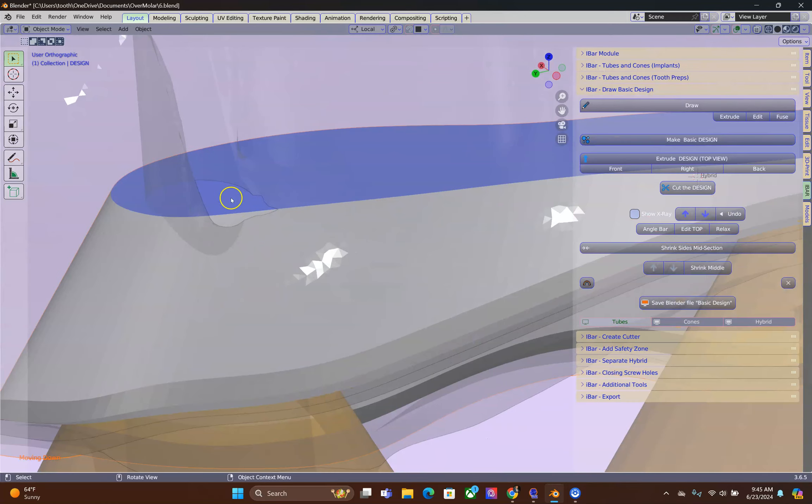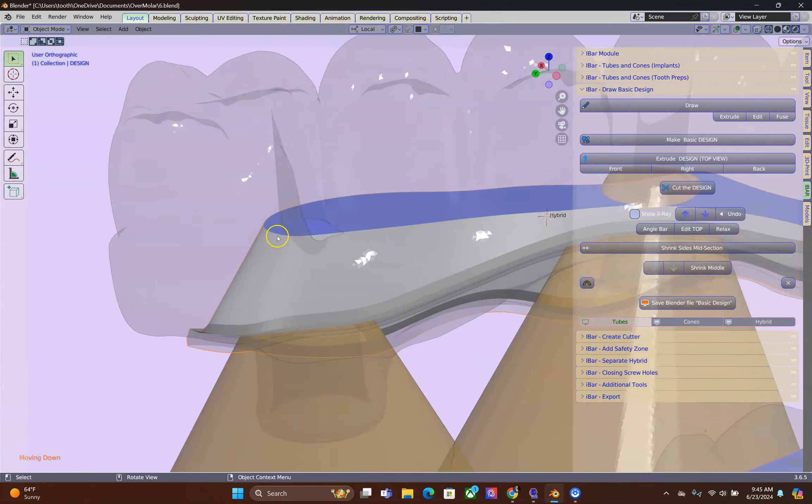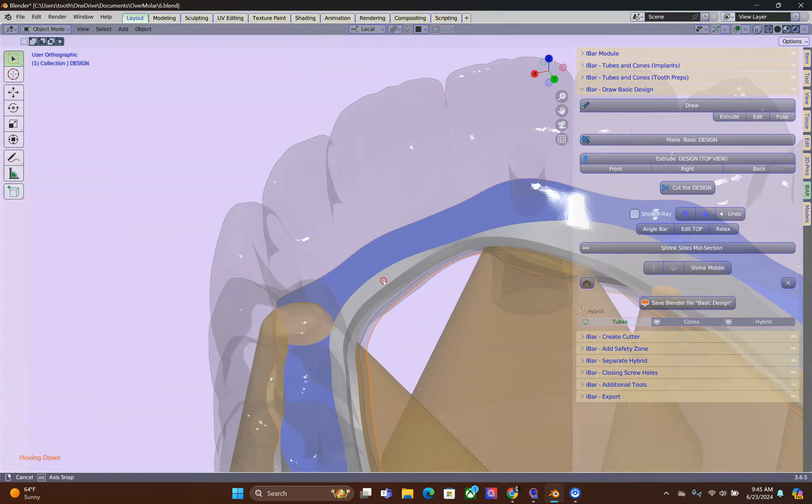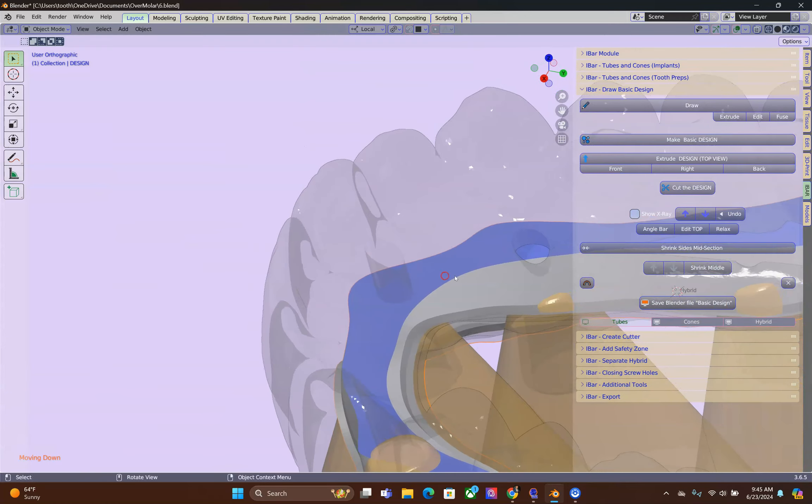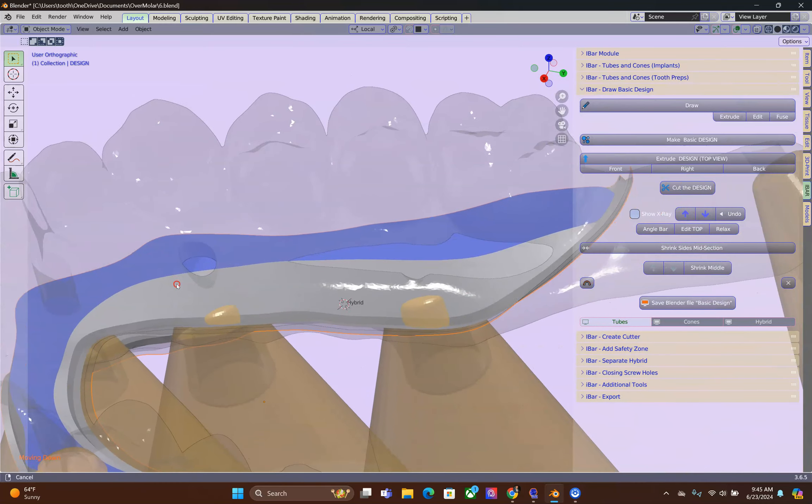Over here with this hole, we still got a problem. But I will deal with it later down the line.